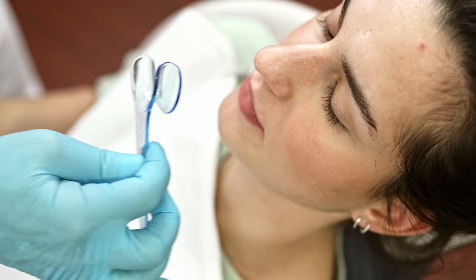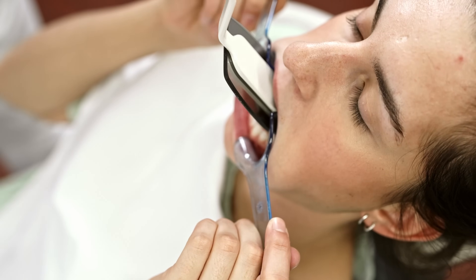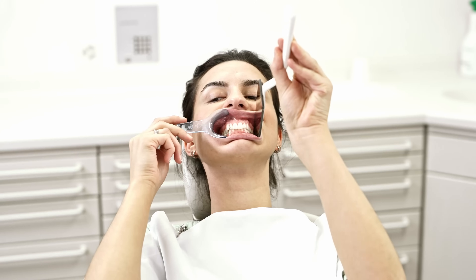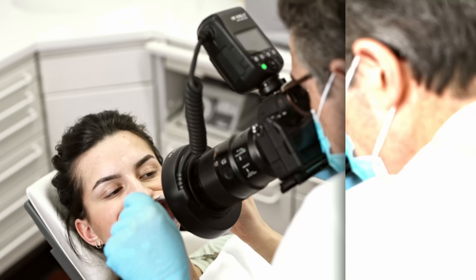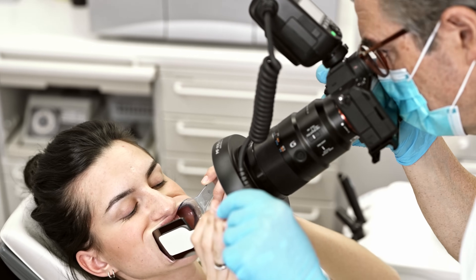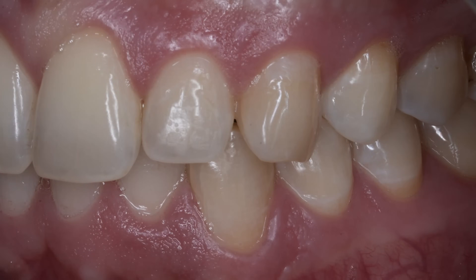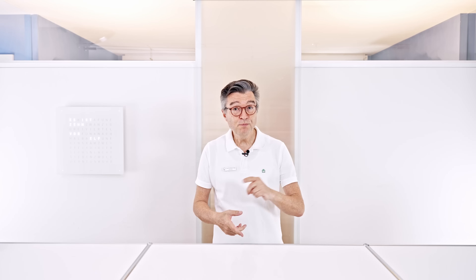Over the years, dental photography has undergone a remarkable evolution. From a mere documentation tool, it has become a versatile tool for our daily workflow — documentation, communication, and even for social media. The need for high-quality images levels up your skills and levels up your position as a dental professional in the community.